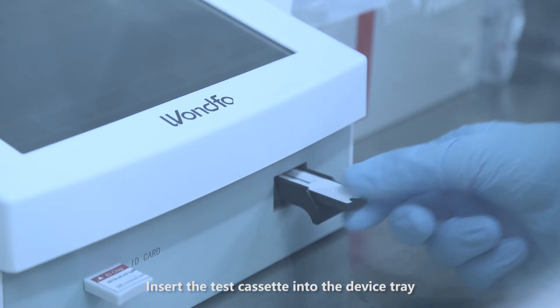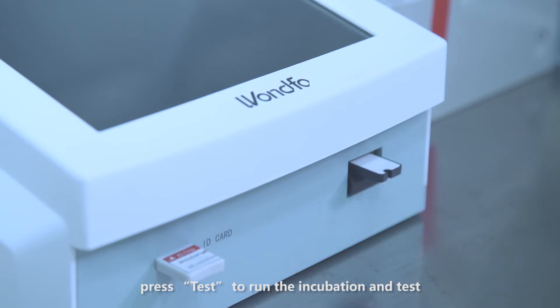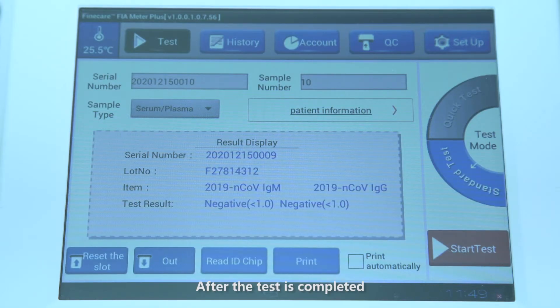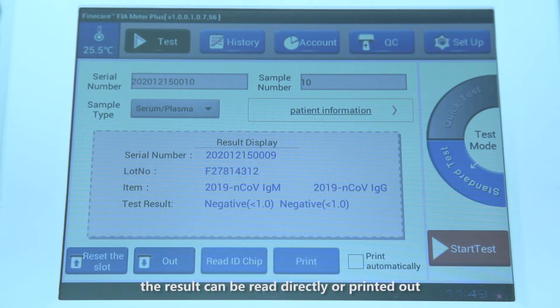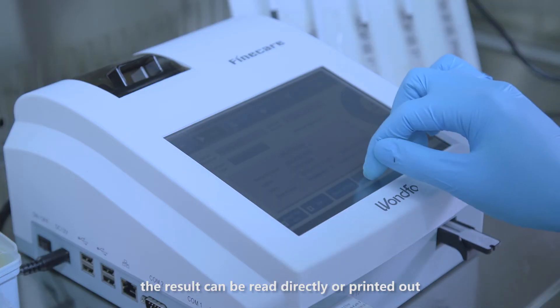Insert the test cassette into the device tray. Press test to run the incubation and test. After the test is completed, the result can be read directly or printed out.